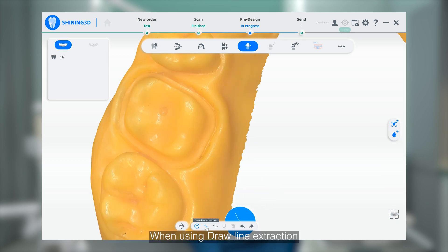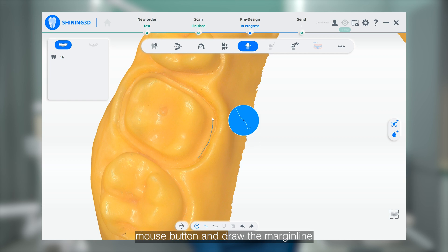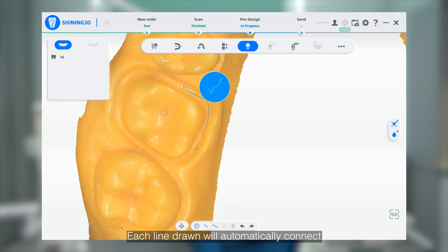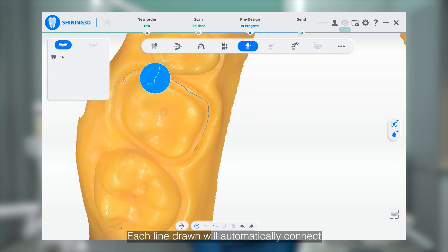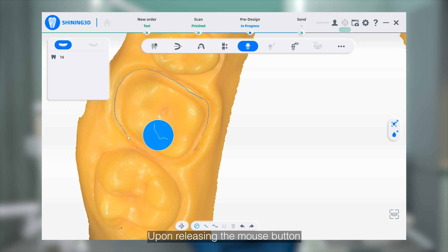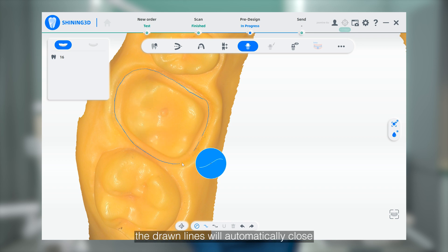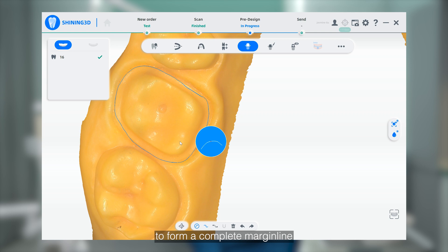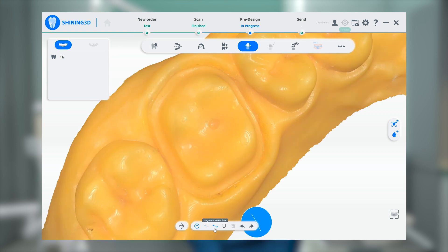When using draw-line extraction, hold down the left mouse button and draw the Marginal line around the tooth. Each line drawn will automatically connect to the previous one. Upon releasing the mouse button, the draw-line will automatically close to form a complete Marginal line.